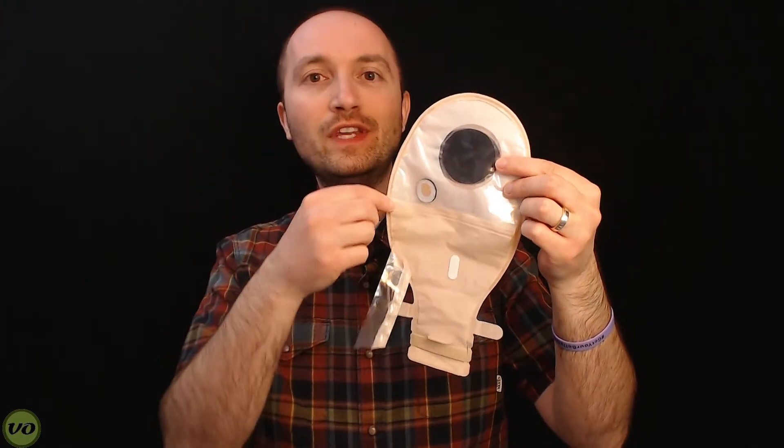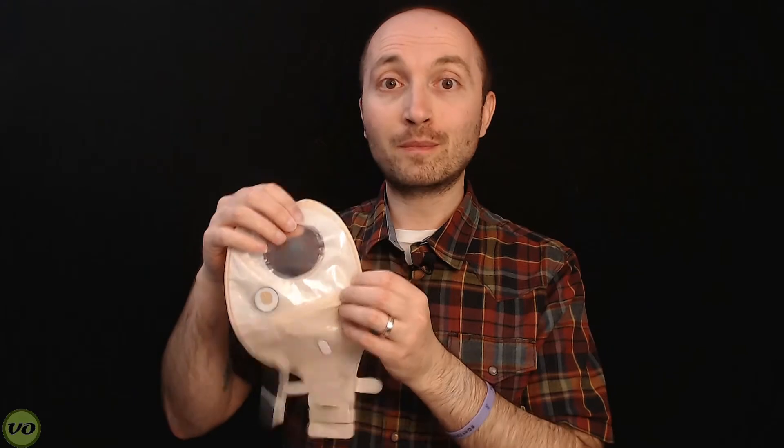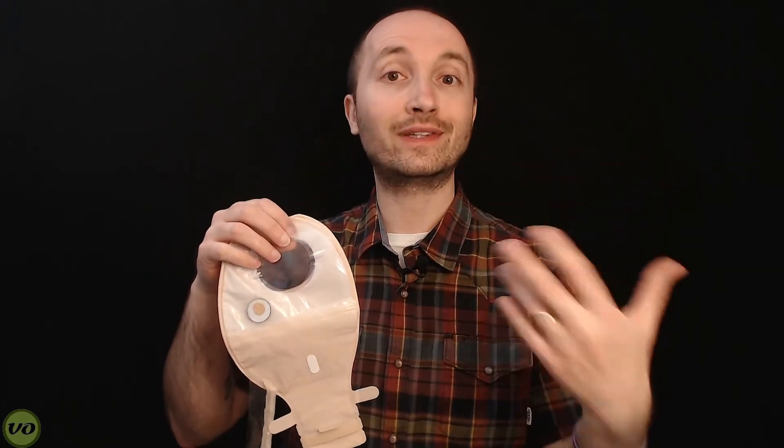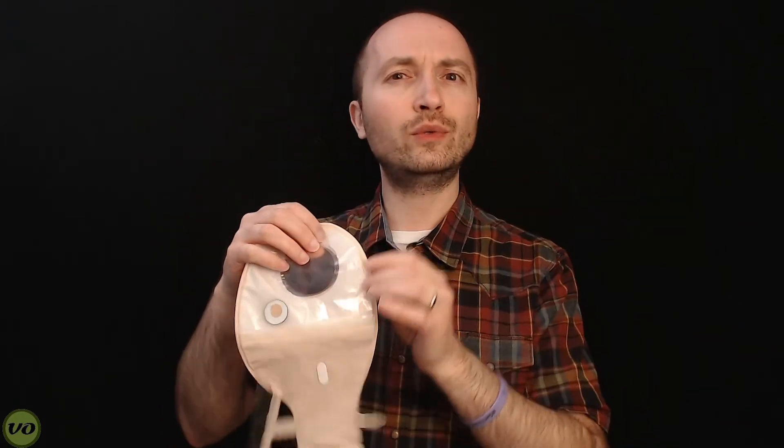Now let's get on to the dissection of this bag, because I really wanted to take this apart and see what's inside. This is a stripped-down bag — I've removed the opaque covering and cut apart some of the layers so you can see. This is something that SALTS is pretty proud of: their filter system. Unfortunately, the filter system didn't work for me. I had ballooning every single day, which is really unusual because with my usual appliance I don't tend to get ballooning at all in the first three or four days. Your mileage may vary — let me show you why it may not get ballooning.